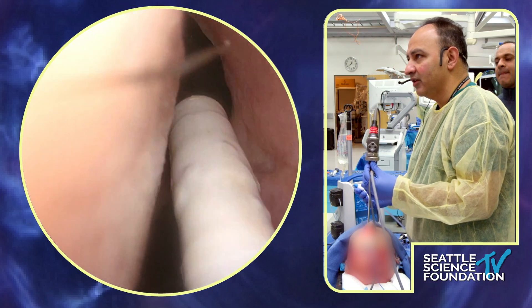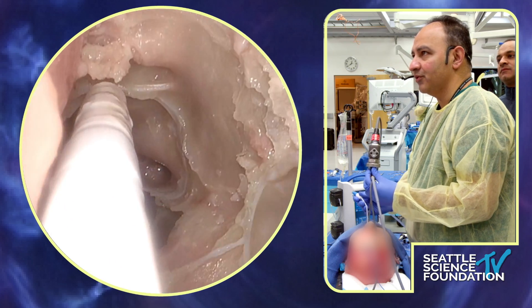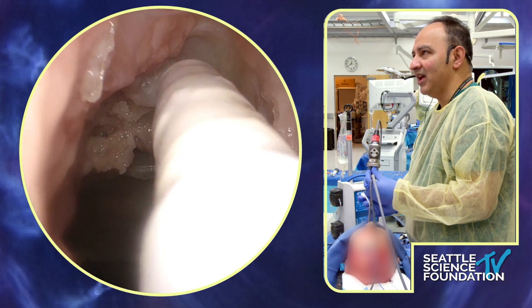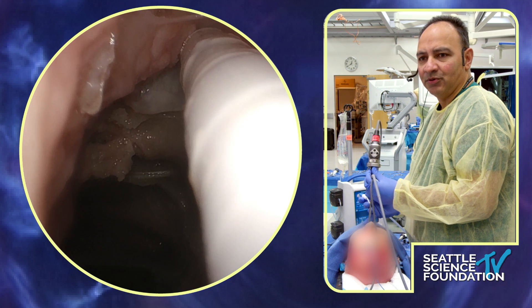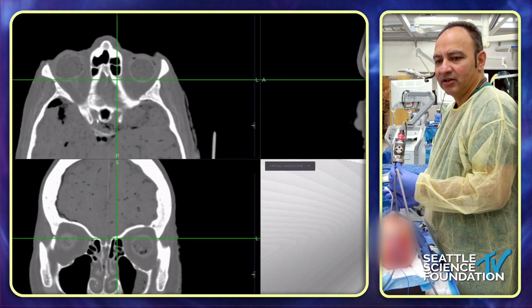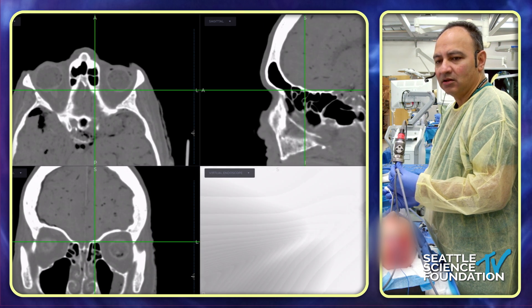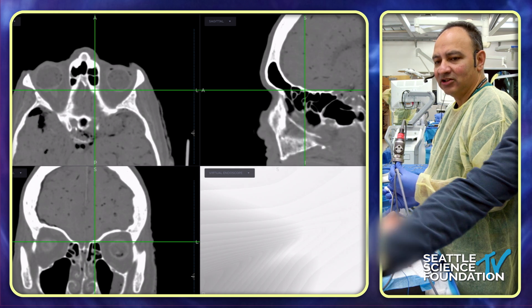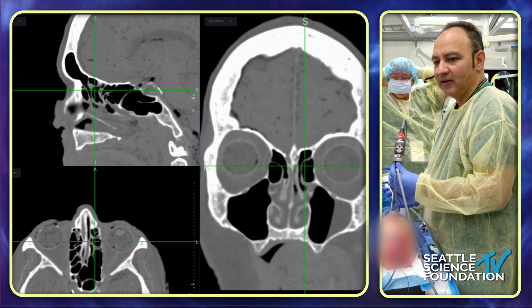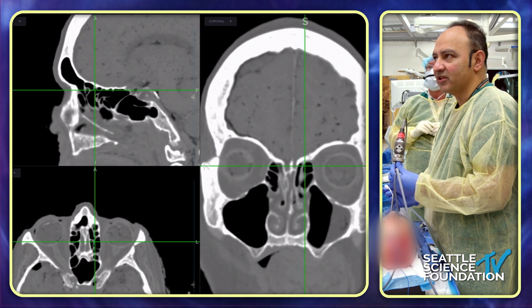What we'd like you to do is actually see if you can identify the anterior ethmoid artery first endoscopically. Someone's done a nice job here with anterior ethmoidectomy — very few cells. You might wonder where the anterior ethmoid artery is. It's going to be up superior here. Navigation can often help because there tends to be what we call a teardrop sign. I think this is the artery here crossing over. If you look at the superior medial aspect of the orbit, there's almost like a little teardrop, like a little pinch — and that can be your clue. If I move forward or back, it's gone, but if I get a little closer, it seems to show itself.